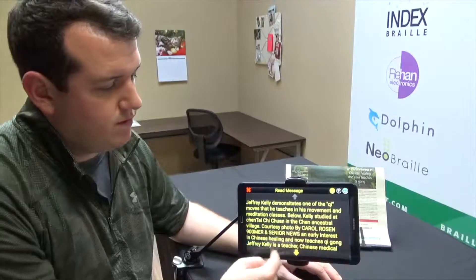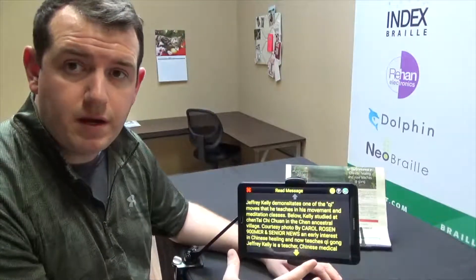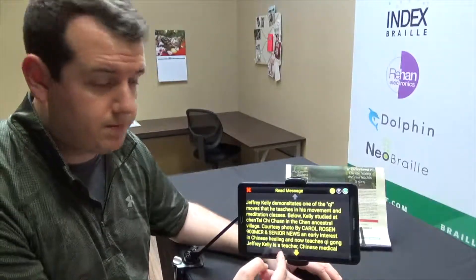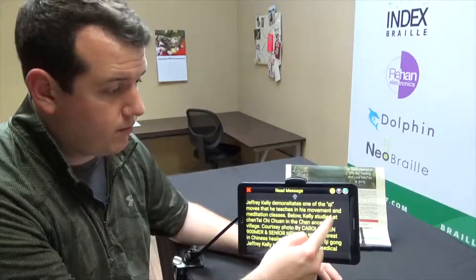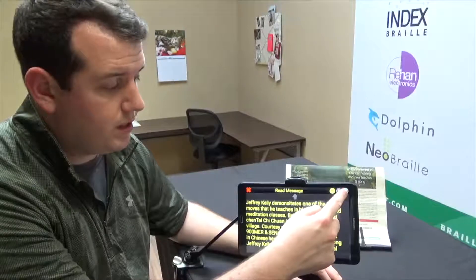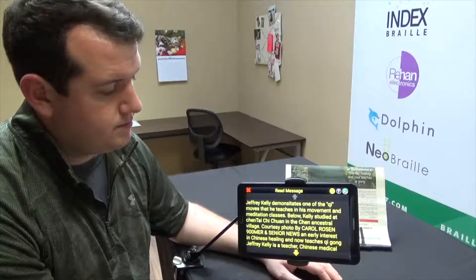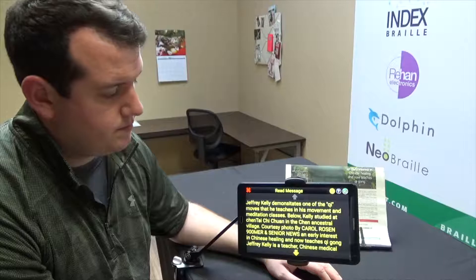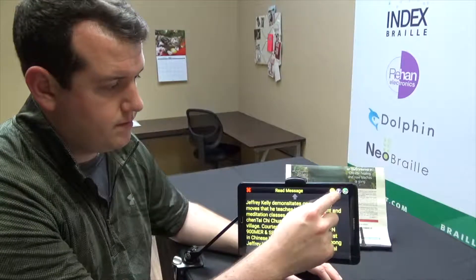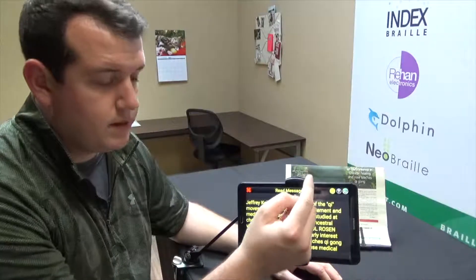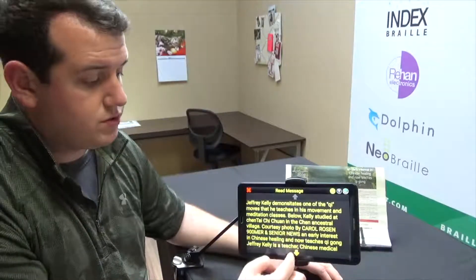Up at the top we also have another way to do it, which shows the content in paragraphs divided up into pages. There's a 'Read All' button in the upper right-hand corner that will read it aloud to you. Let's give that a try — 'Jeffrey Kelly demonstrates one of the chief moves that he teaches in his movement and meditation classes.' I'll stop that — that's one way to do it.